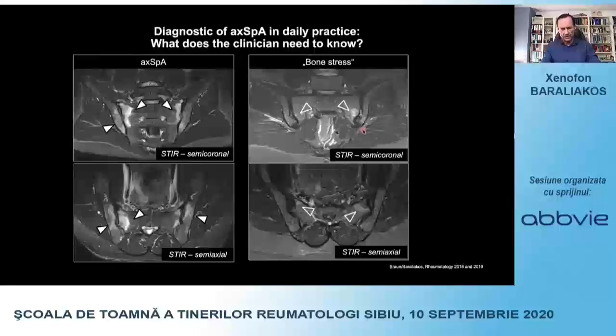I'm talking about means now, not everything is black and white, obviously, and more in the anterior part. That's the gut, and that's the back. So more in the anterior and in the lower part of the sacroiliac joints, and that's important information when you interpret MRIs that may not be positive, or not for you, the patient may not be positive in clinics, but the radiologist says, well, there is sacroiliitis or there is inflammation. I just had a patient yesterday on that.